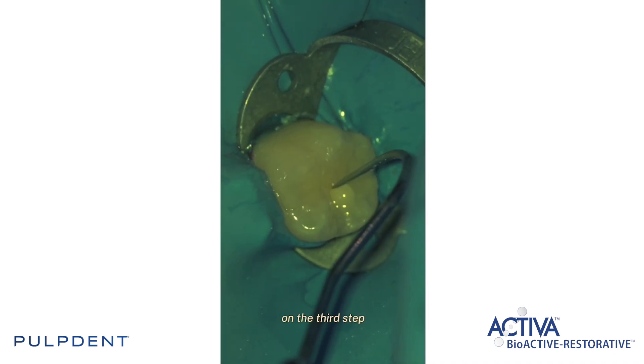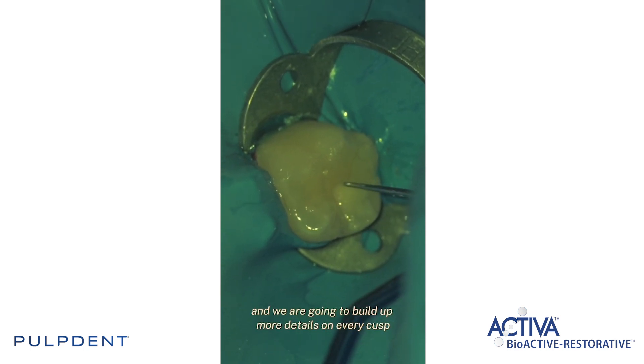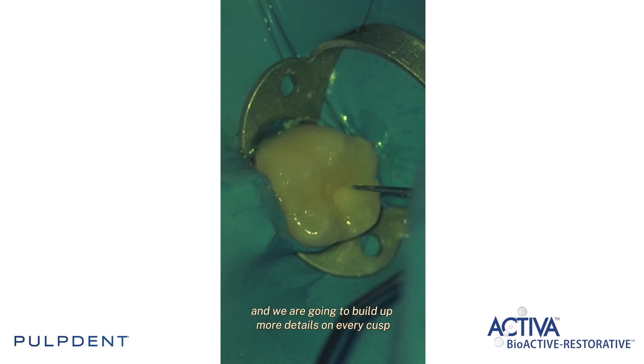On the third step we're going to start applying little increments and we are going to build up more details on every cusp.